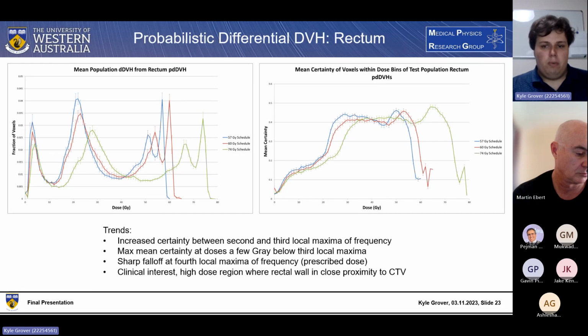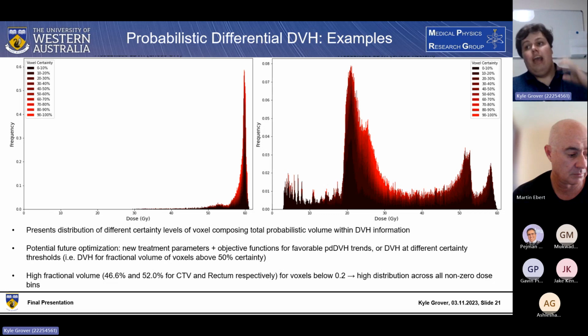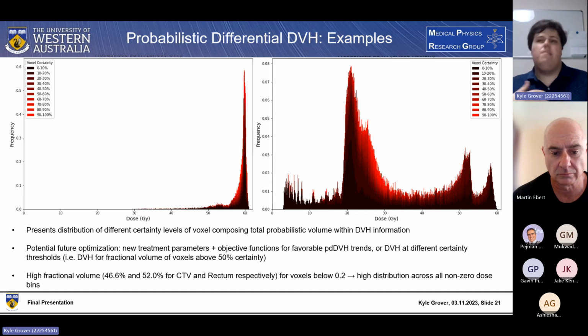You could even strip back and say, I want to look at the region that we are very certain about, say with a threshold that they need to be above 60% accuracy, and see how important that is in the actual NTCP calculation, providing a specific weighting and optimization that could improve the overall NTCP calculation that you could give.